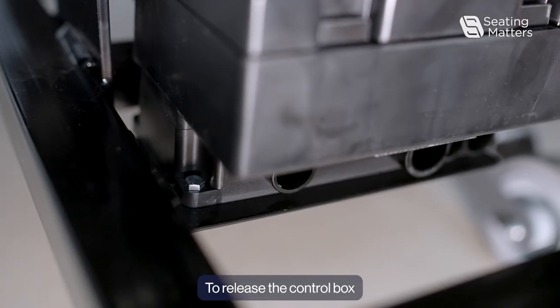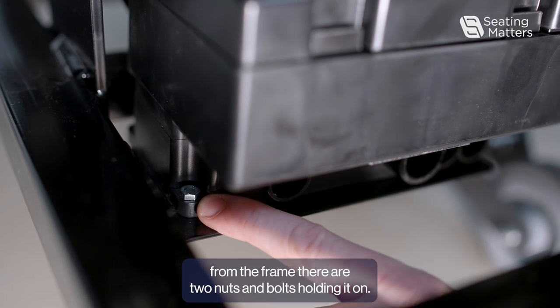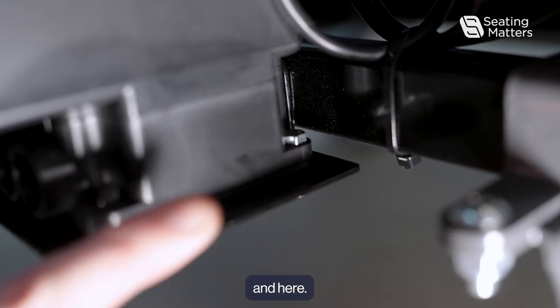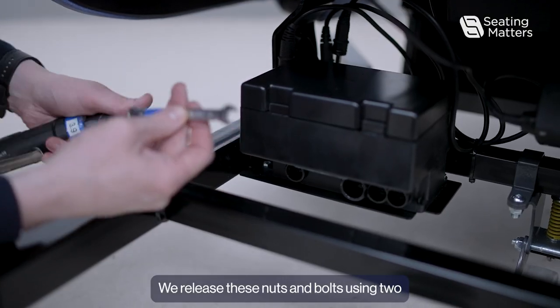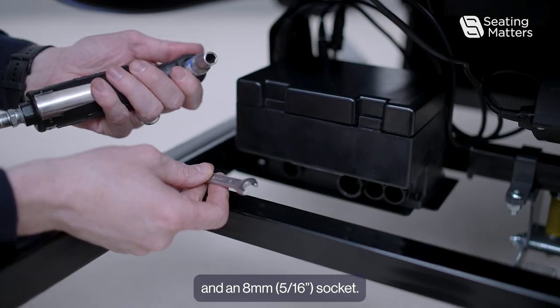To release the control box from the frame, there are two nut and bolts holding it on — one located here, and here. We release these nut and bolts using two 8mm spanners, or an 8mm spanner and an 8mm socket.